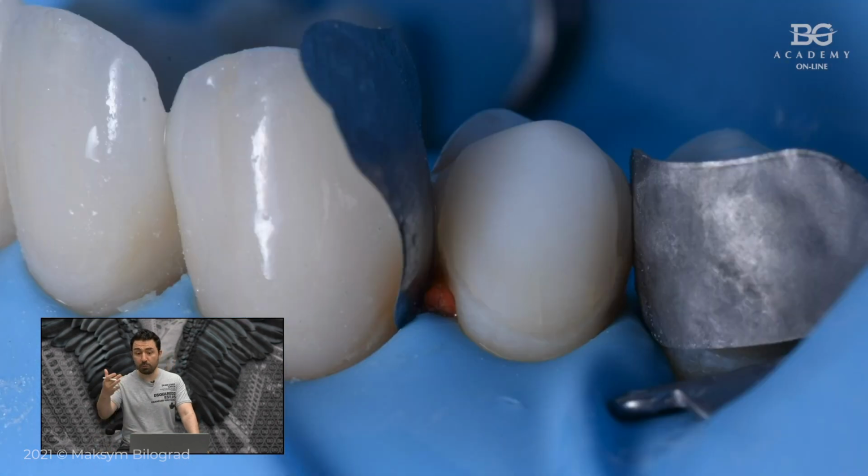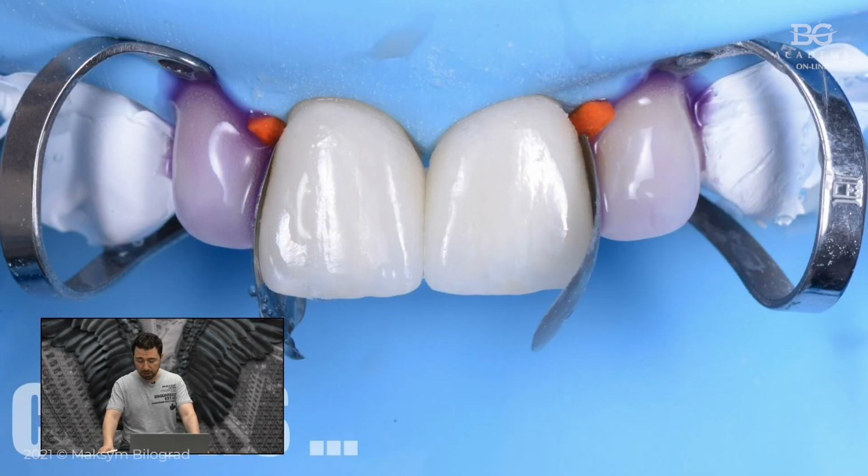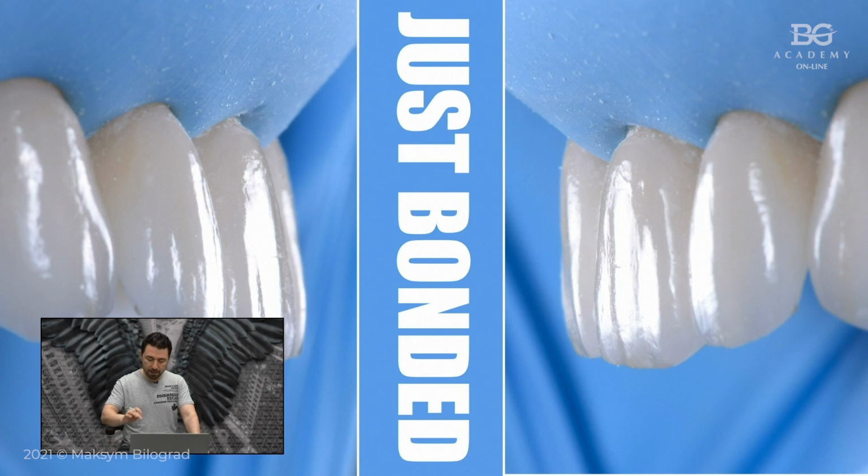Premolars, with no preparation from the vestibular side in this case, just a finish line in the cervical area and in the proximal areas, just to guide our dental technician regarding the position of the veneer. Here we also have another artistic picture, just bonded.